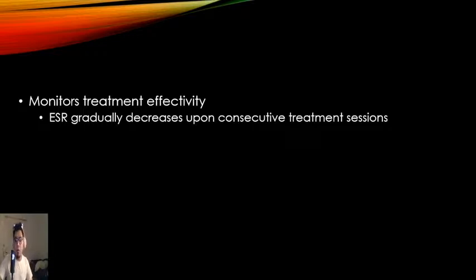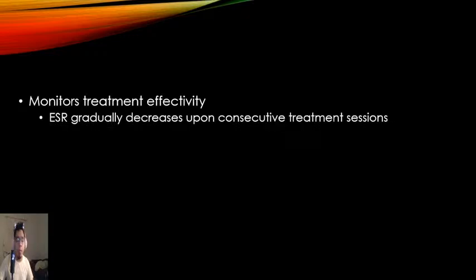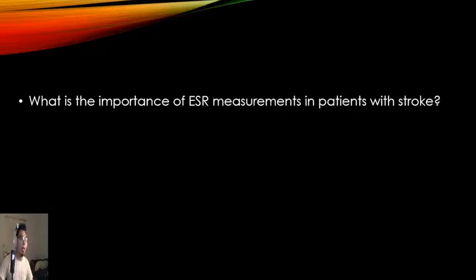Okay? So, they are often monitored with serial ESR measurements. Every week, a patient with osteomyelitis would need blood taken, once a week, just to see the effectivity of the treatment that these patients are undergoing. Okay? Next, importance of ESR measurements for patients with stroke.